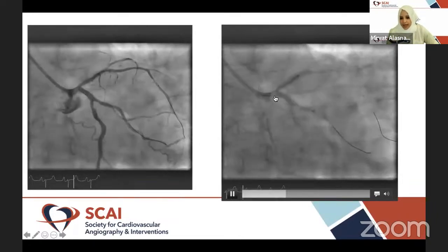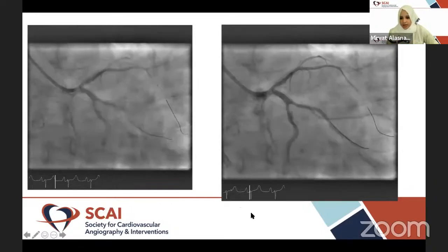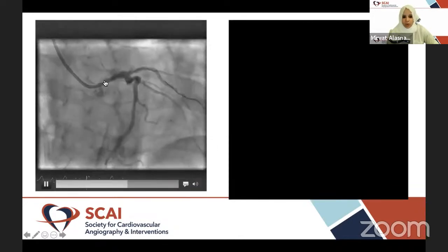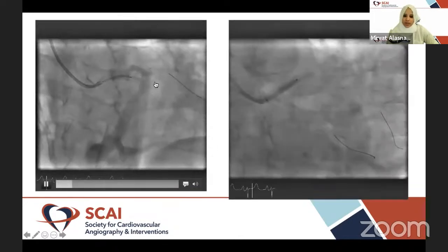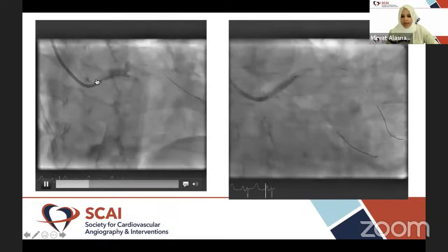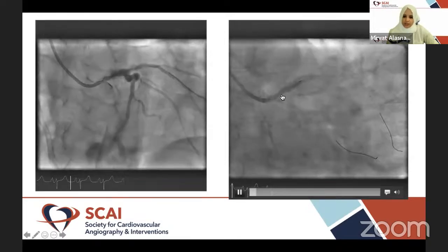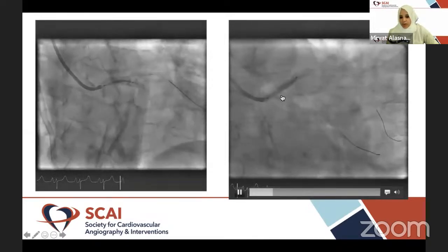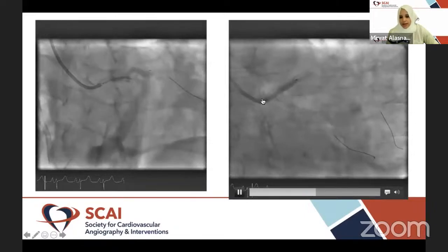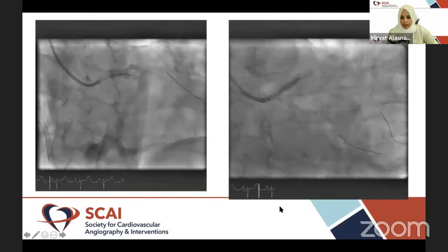We opted to go ahead. We took the length and size from the OCT imaging. We're going to take different positions just so that we make sure we're back. So this is a cranial shot that's helping us position the stent into the left main across the circumflex, but going into the LAD and starting at the ostium. The image on the right shows you that we do have our wire trapped in the circumflex, and we are expanding, and the stent is expanding very nicely over here.